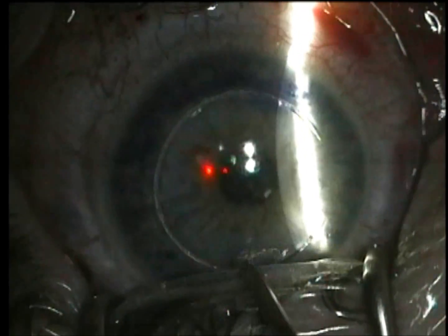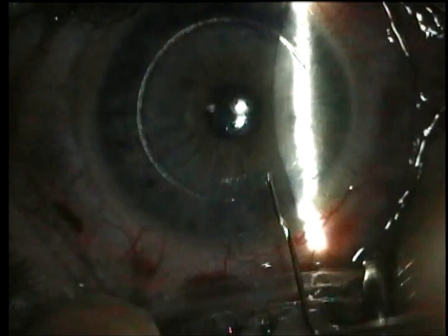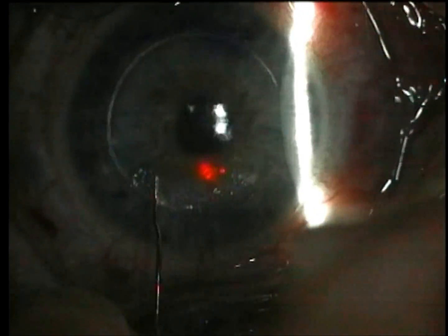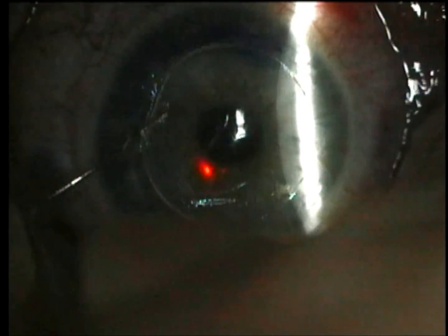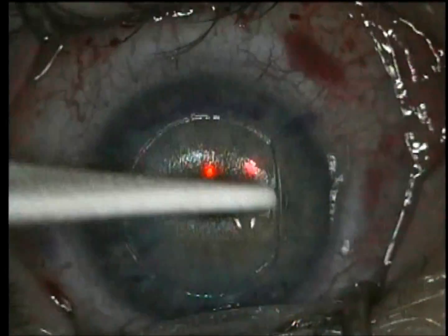We go about 20 microns deeper and then it's usually pretty easy to break into the old flap. We're using a Slade lifting spatula here and then it's comparatively easy to lift.